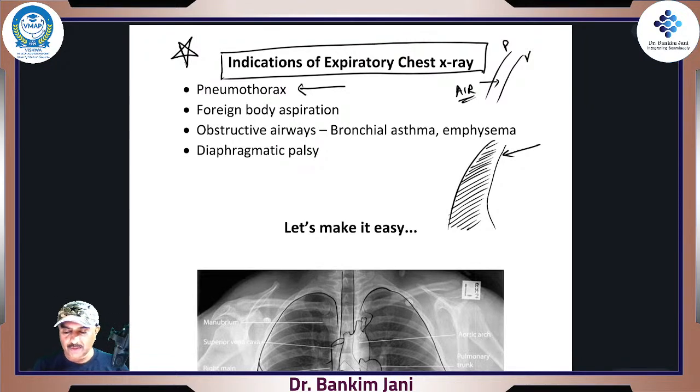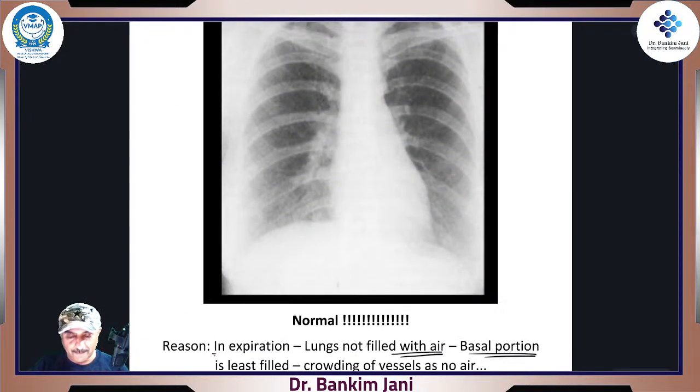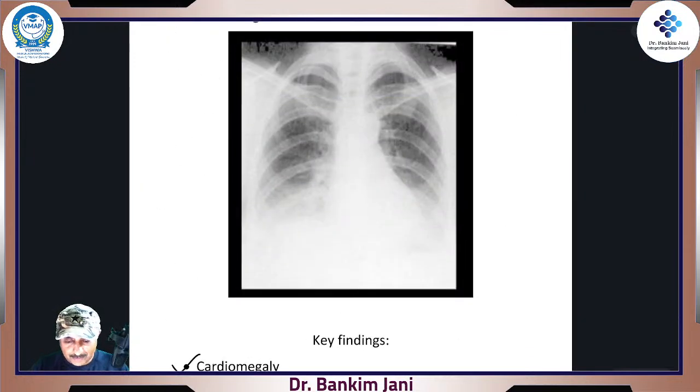So at that point, you are more interested in whether any foreign particle has entered, right? That would be seen more clearly against this contrast, because a foreign particle causes a very sharp shadow. I'll show you a few of the X-rays later on. Say if there is a coin, that coin is seen so crisply because it is an artificial object. Any artificial object will have a beautiful margin because it is not part of the body. That's why it poses clear-cut shadows.